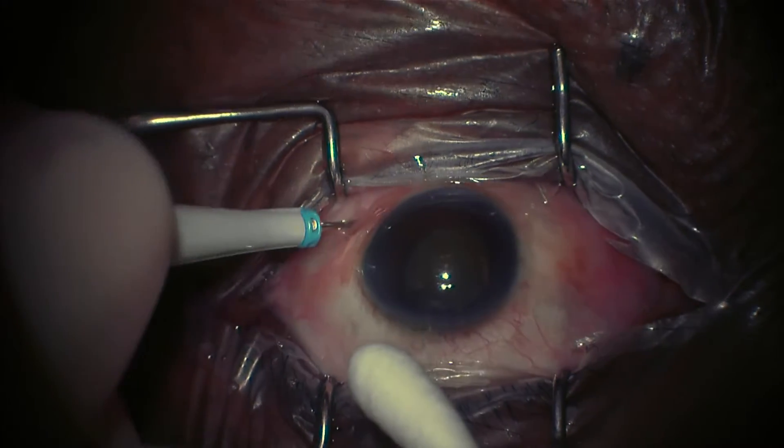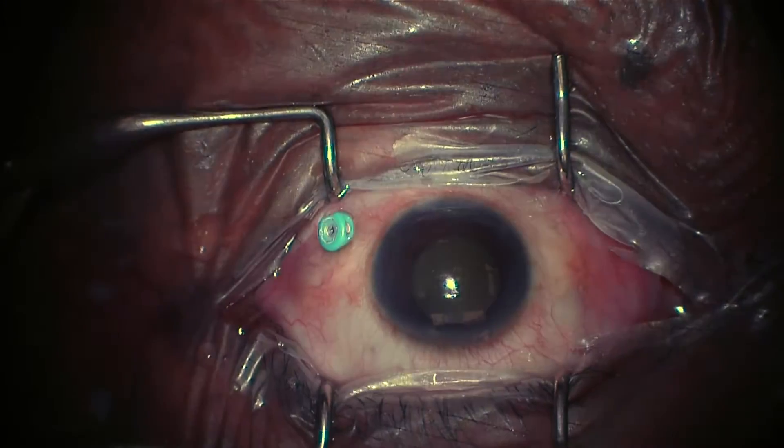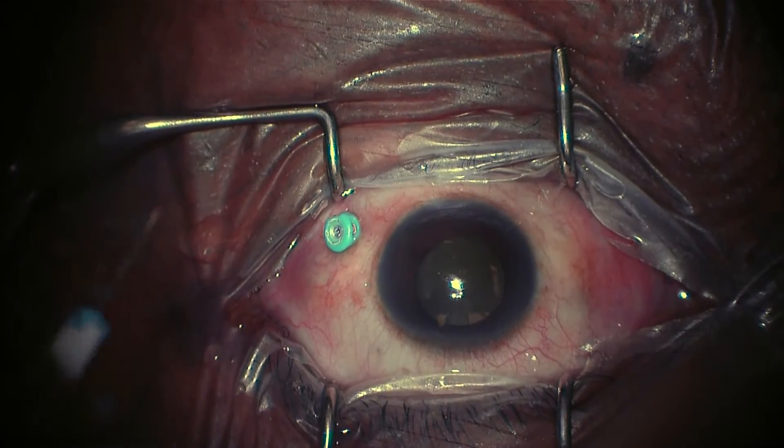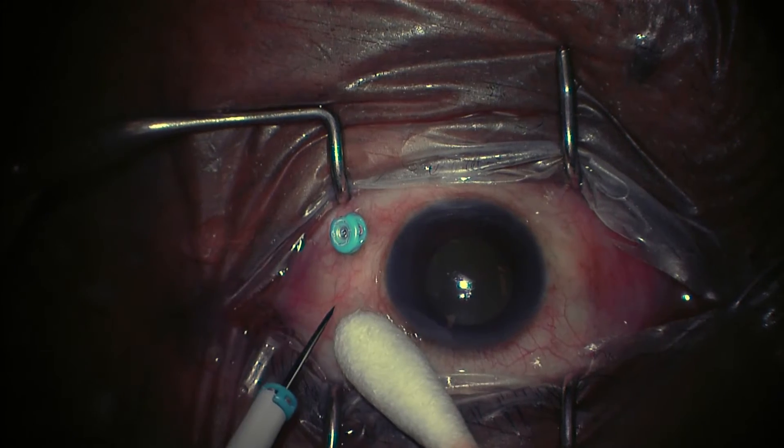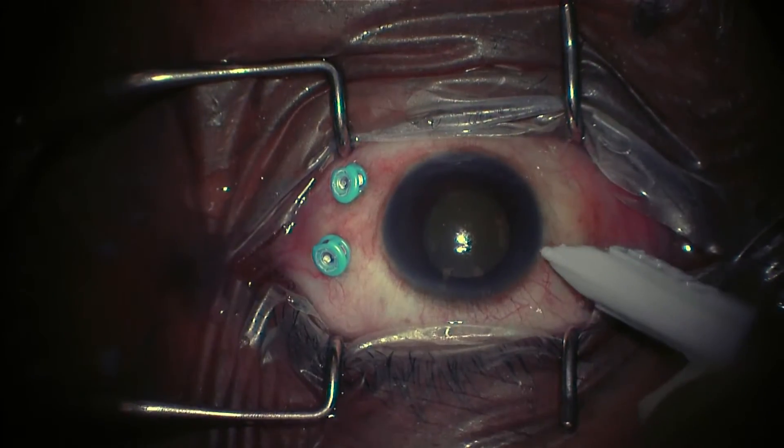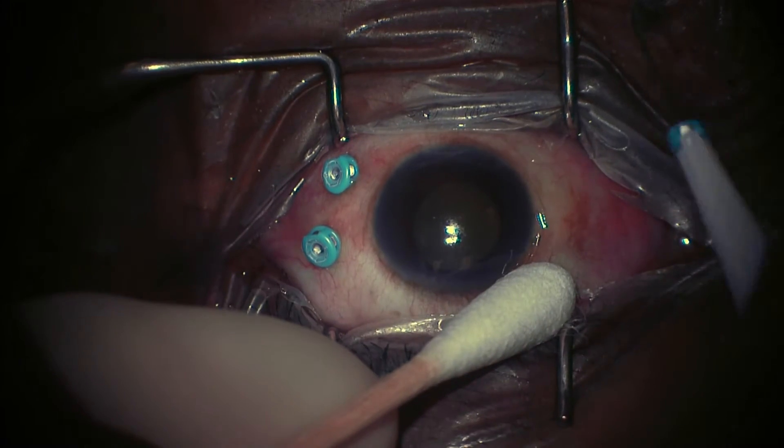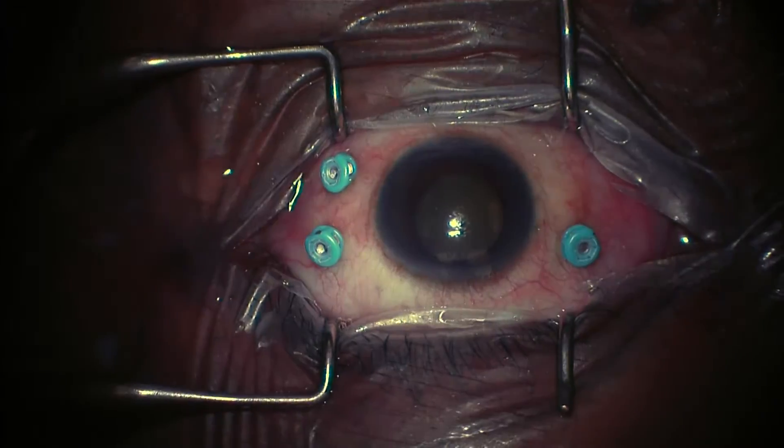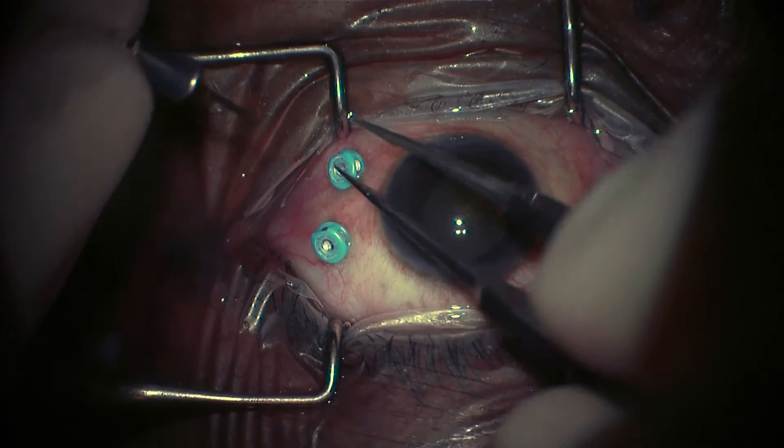We're going to start by putting in our ports for standard three-port pars plana vitrectomy. We're sitting superiorly, and this patient has surgery for the left eye, and we're going to put an inferior temporal port and then two ports superiorly, superior temporally as well as superior nasally. They're four millimeters posterior to the limbus because this patient is phakic.